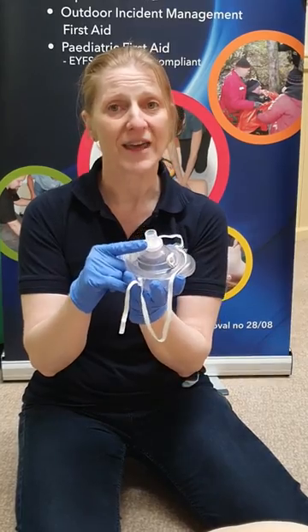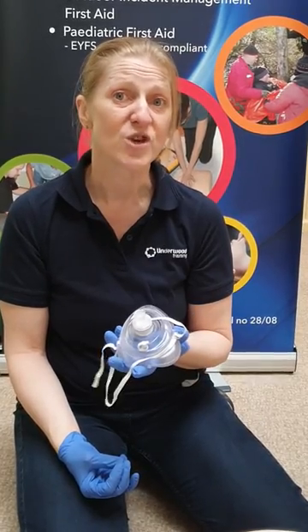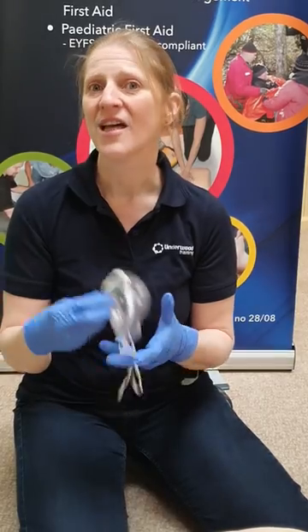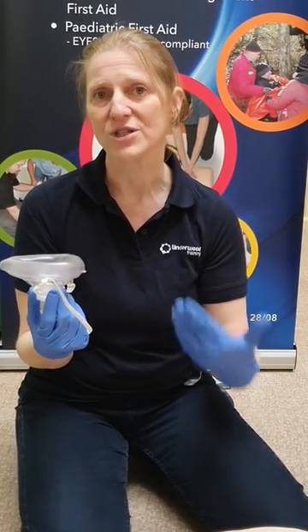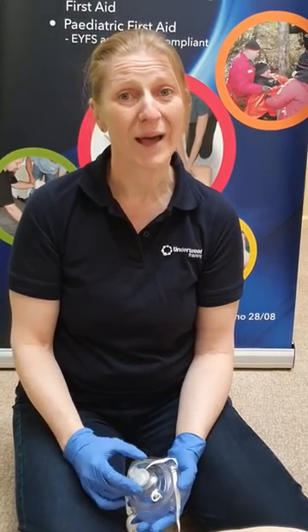Because of this lovely one-way valve here, it puts you at very little risk of picking up any bugs that your casualty may have. So if you're considering doing full CPR, for me with a nut and peanut allergy this is a must — otherwise I would choose to do compression-only CPR if I do not have a one-way mask, or even better, a bag valve mask if you're a healthcare professional.